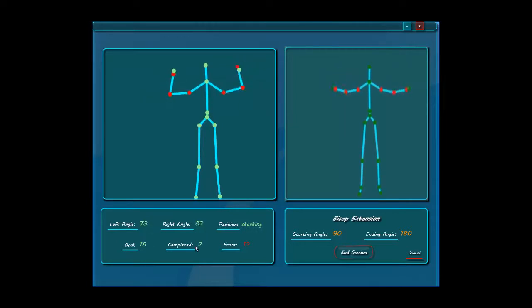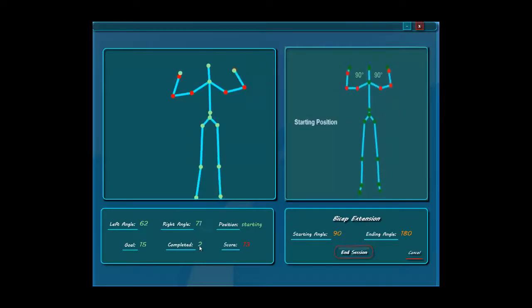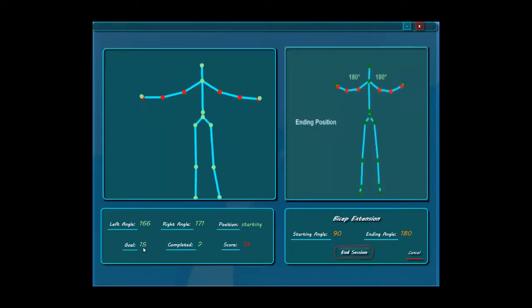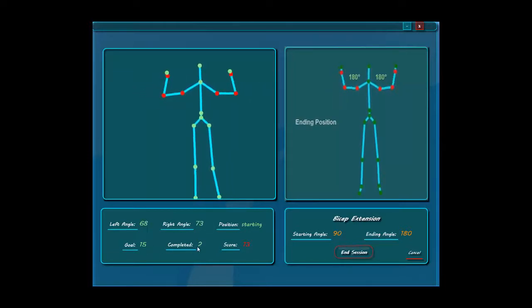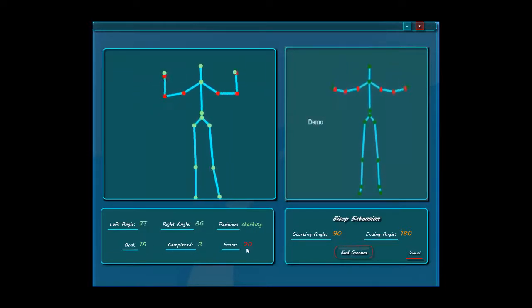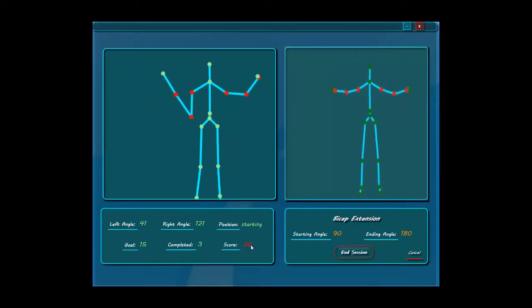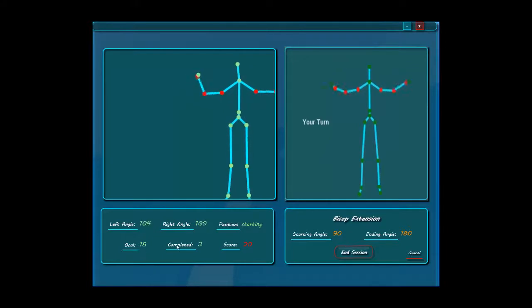Not only that, but the Kinect tracks the completed exercises. As he completes each exercise, the score goes up. Right here you see the goal that the doctor has assigned — the number of repetitions you're supposed to complete. And as you keep completing those exercises, the score keeps going up based on how many you have completed.